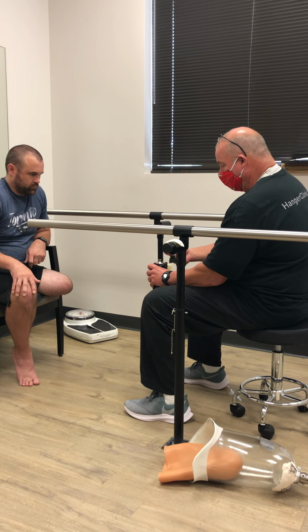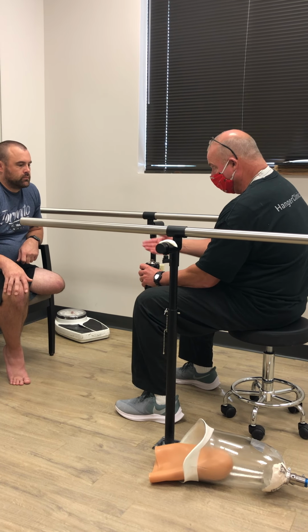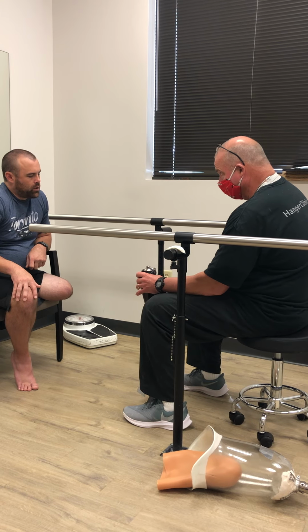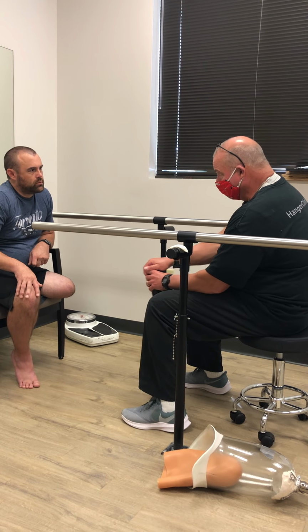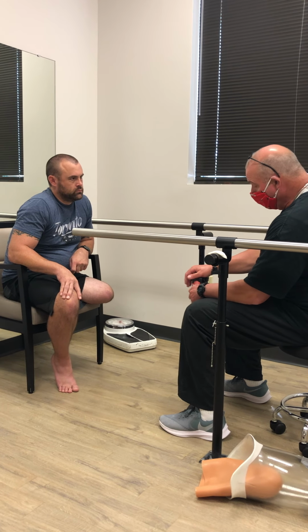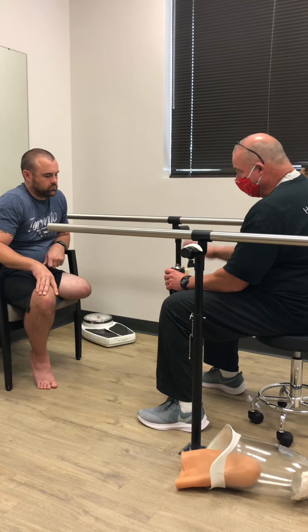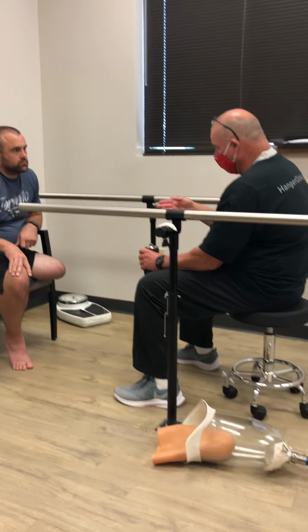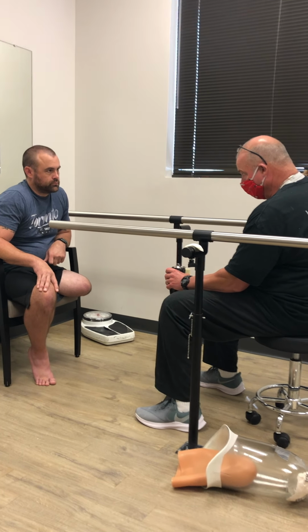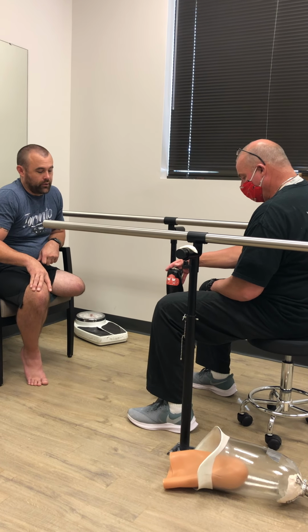When you do that, now the knee just got unstable because you shifted the weight line probably in front of the knee, or behind the knee, which is gonna make the knee unstable. Now, the good news is you've got the most advanced knee in the world. So will it be a huge problem for you? No. However, if you have a big discrepancy between the two, a 1/4 inch or something like that, what I can do is we'll align it to the higher heel shoe, probably the work shoe.